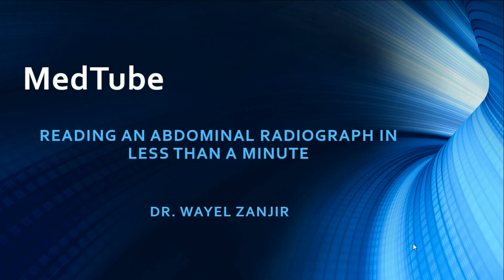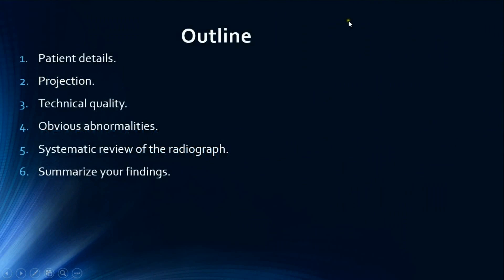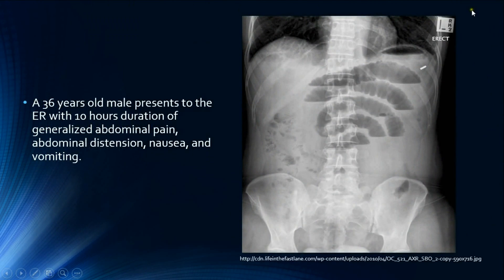Hello and welcome to Medtube again. Today I will demonstrate how to read an abdominal radiograph in less than one minute using the steps we explained in the previous video. We will be taking this abdominal radiograph as an example. The patient is a 36-year-old male presenting to the emergency department with 10 hours of generalized abdominal pain, abdominal distention, nausea, and vomiting. Before commenting, we'll first step back and have a general look at the radiograph to get a complete view.